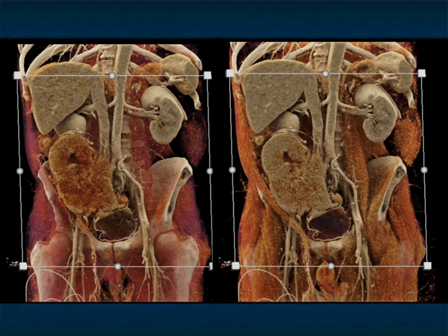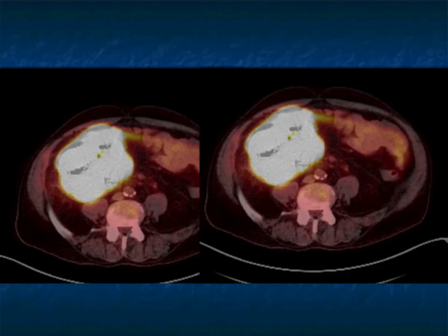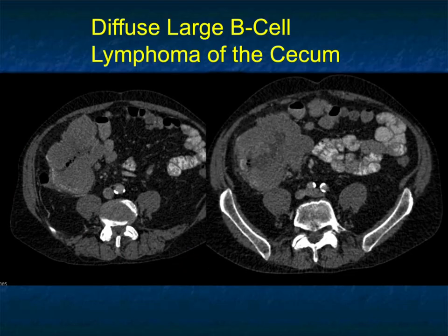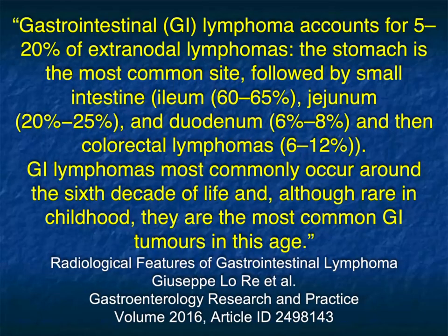Takeaway messages: when you see a bulky tumor, think lymphoma — particularly in the right colon. Look for ileal involvement. While an adenocarcinoma can obstruct the ileum, lymphoma is more likely to directly infiltrate into it. Colon lymphoma, like small bowel lymphoma and gastric lymphoma, is very positive on PET scan. A very nice example of diffuse large B-cell lymphoma.